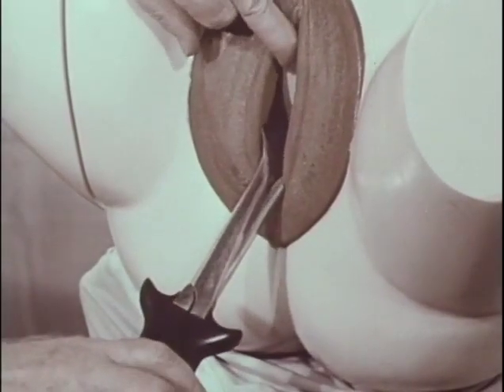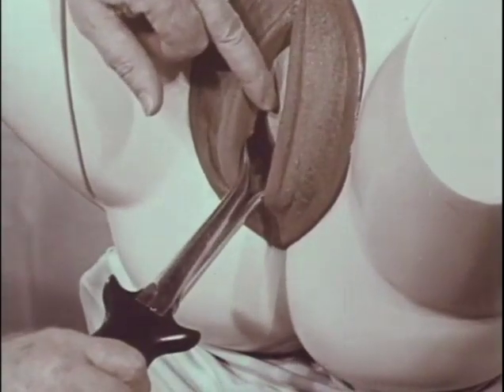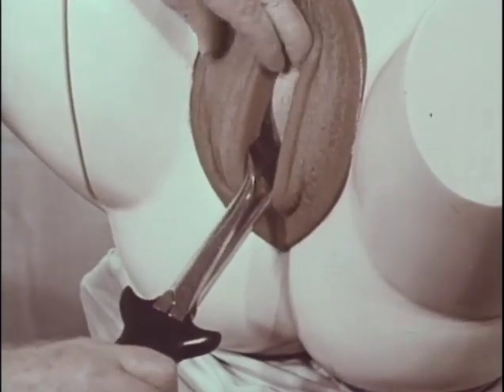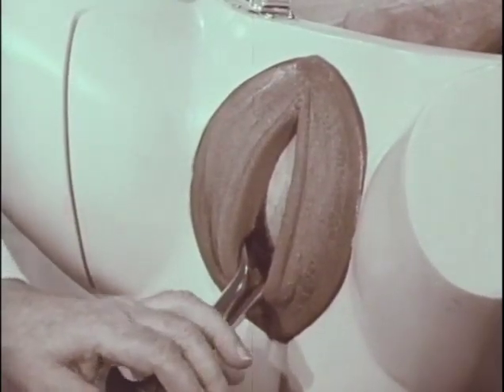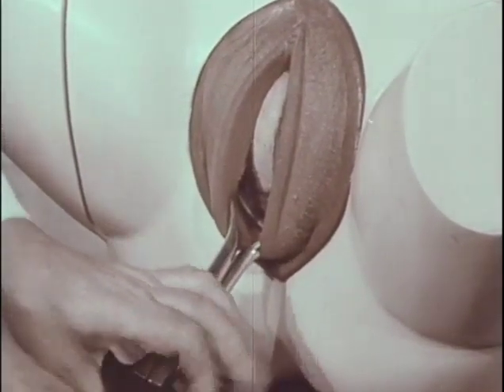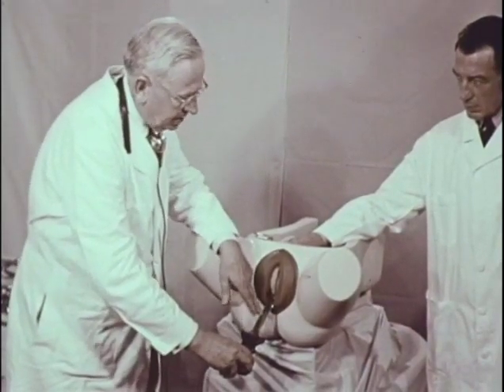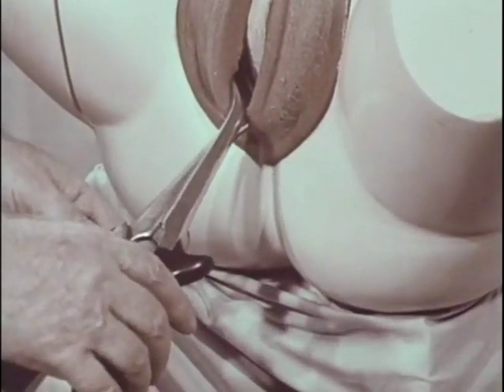One has to be careful about the rotation of the occiput at the symphysis, so that the anterior blade won't cause damage to the anterior wall and urethra. After rotation to as far as the LOA position, one gives the initial traction downward, bending the handles toward the floor to fix the head in a new position. However, it won't be possible to deliver the baby's head in this position because the blades are upside down. And this calls for the second maneuver of the removal and reapplication of the forceps.